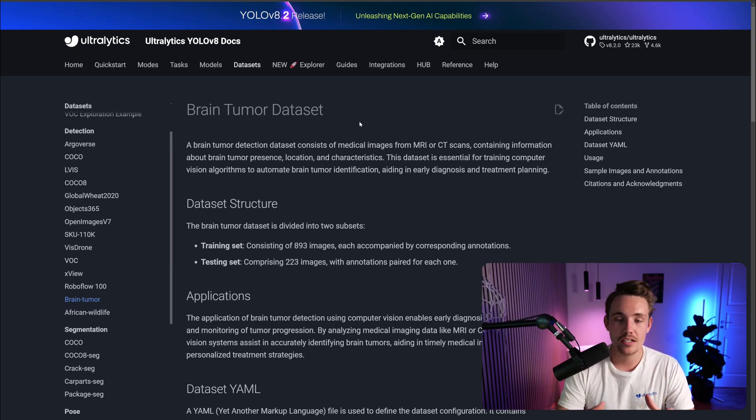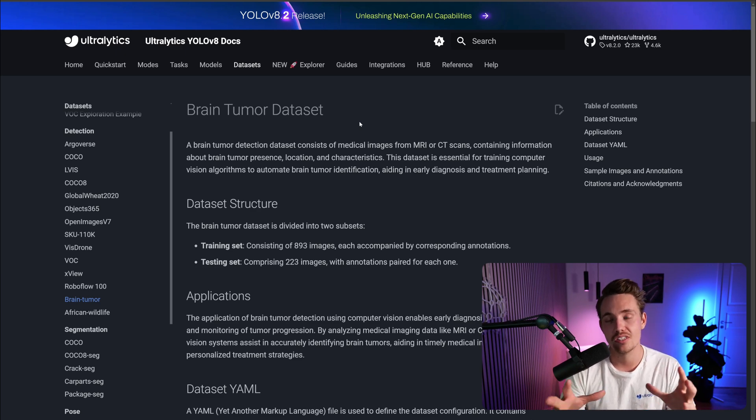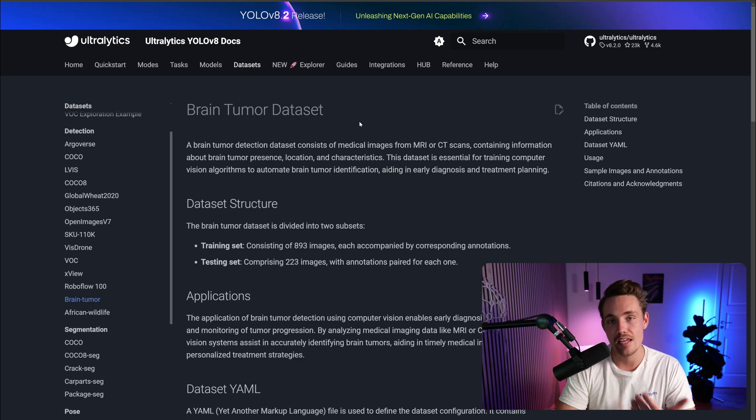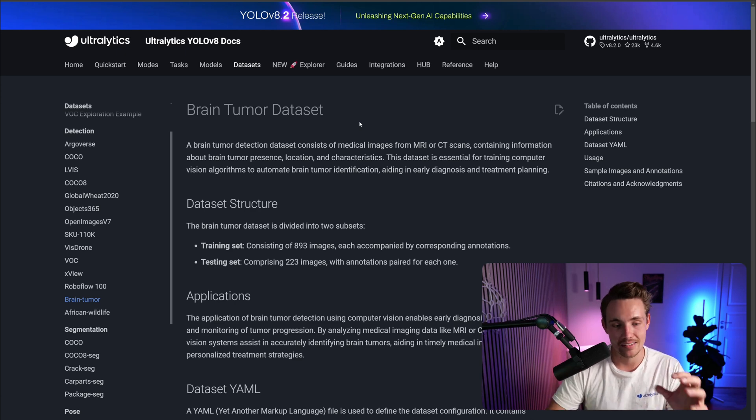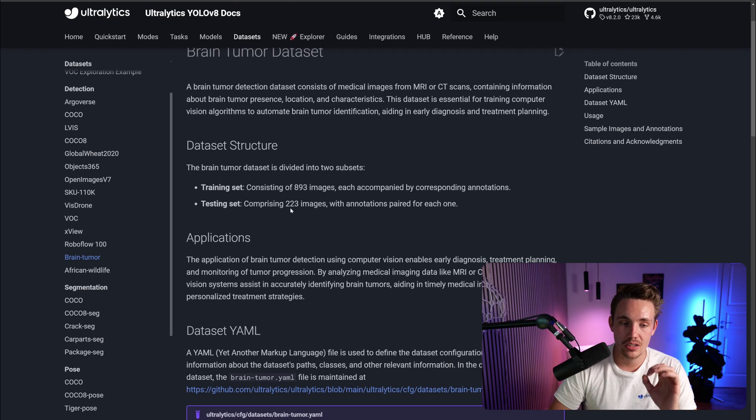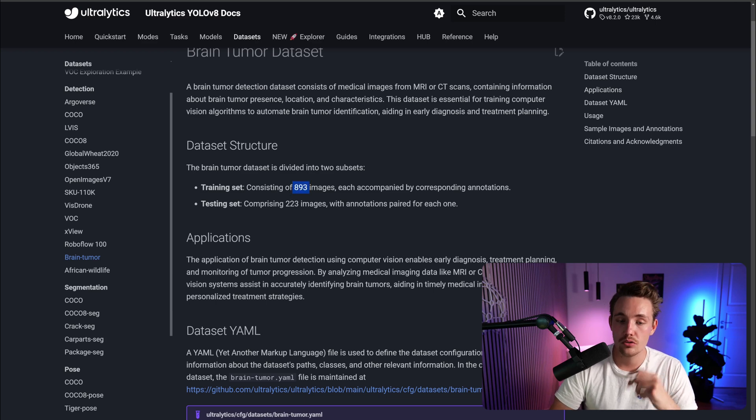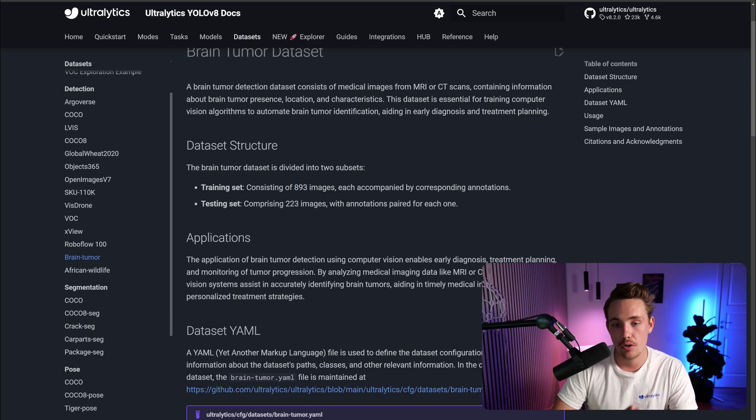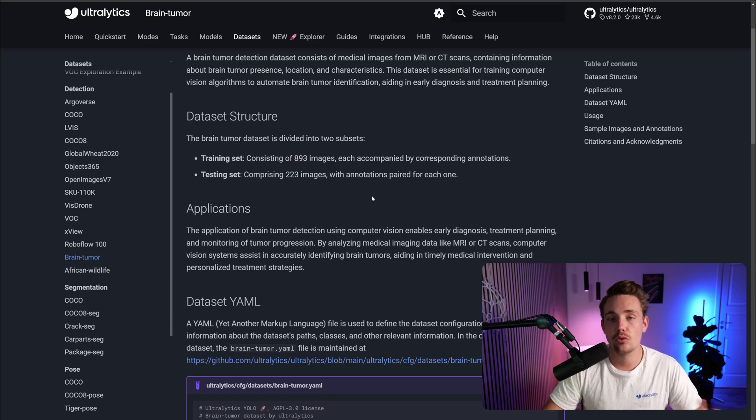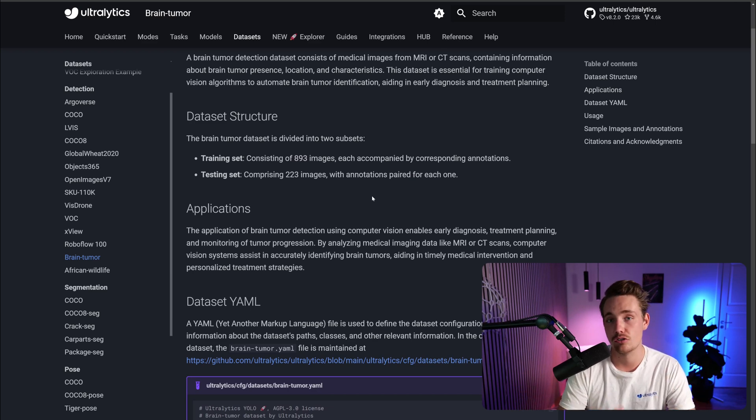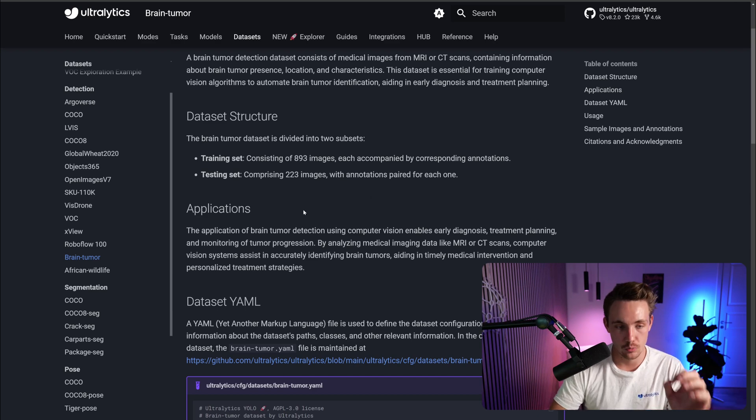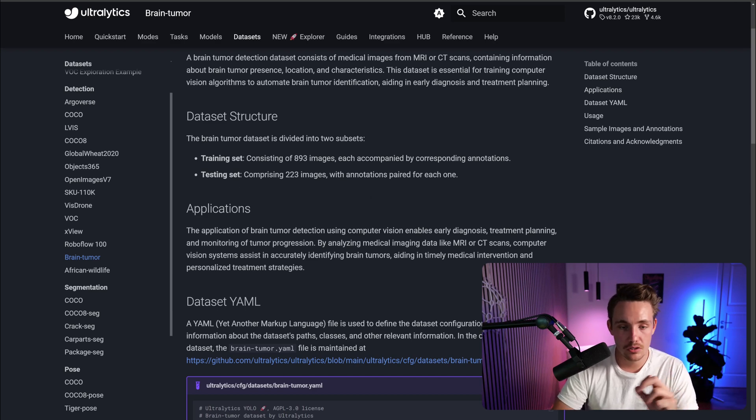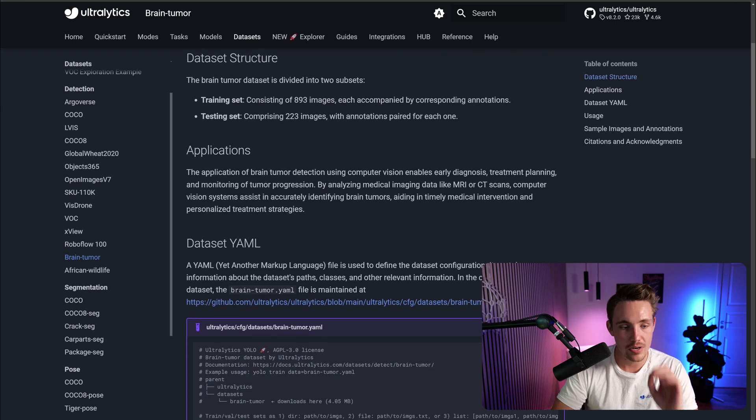From these scans, it will contain information about brain tumor presence and also location. We're going to detect both the location and if the brain tumor is positive or negative. For the dataset structure, we can see that we have a training set of almost 900 images with corresponding annotations that you can use directly. If you want to try to solve this problem or use it for a specific application and project, you can use the dataset in here. We have a test set here with over 200 images with all the annotations directly.